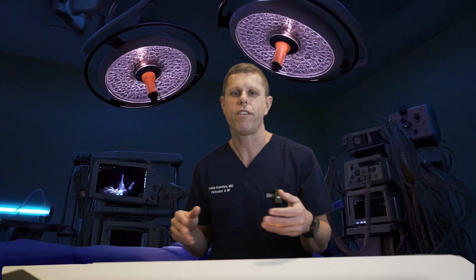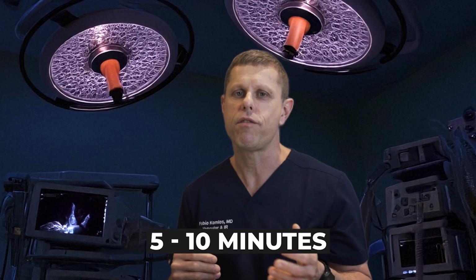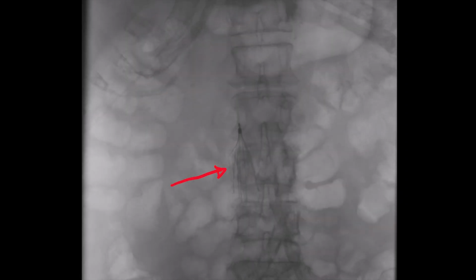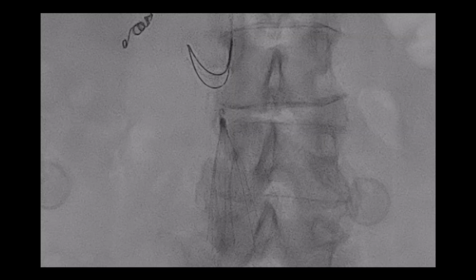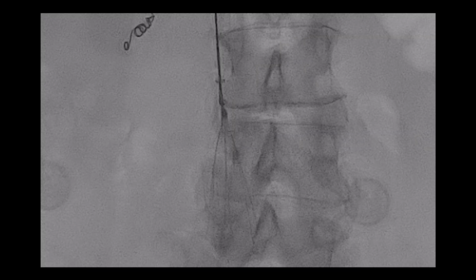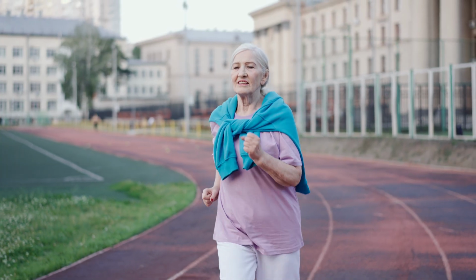Now, the filter removal is a very simple procedure as well, although it's one more appointment. I know everybody's busy. But as far as procedures go, it's a 5 to 10 minute procedure. Like I mentioned before, we insert a little tube in the vein, usually from the neck, just because usually the hook is on the top of these filters. And through this little tube, we then insert a snare that we use to grab the hook of the filter, and then the filter collapses again and can be easily removed. We don't usually stop the blood thinners to remove the filters, so patients can continue to be on the blood thinners, and patients can essentially resume normal activity by the next day, even playing sports or going to the gym.